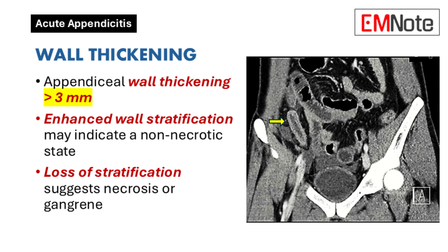Wall thickening: The appendiceal wall typically thickens to more than 3 mm in cases of appendicitis. Enhanced wall stratification may indicate a non-necrotic state, while loss of this stratification suggests necrosis or gangrene.